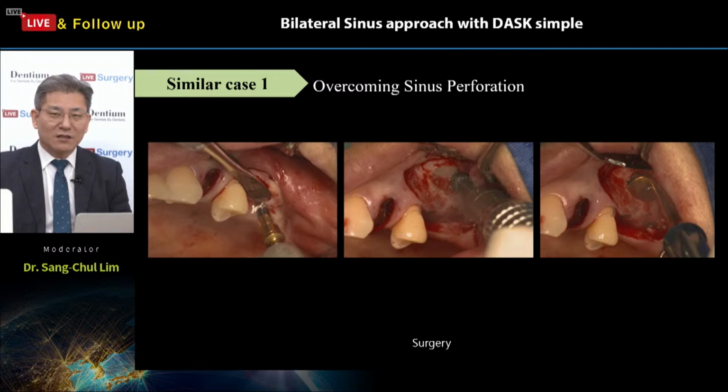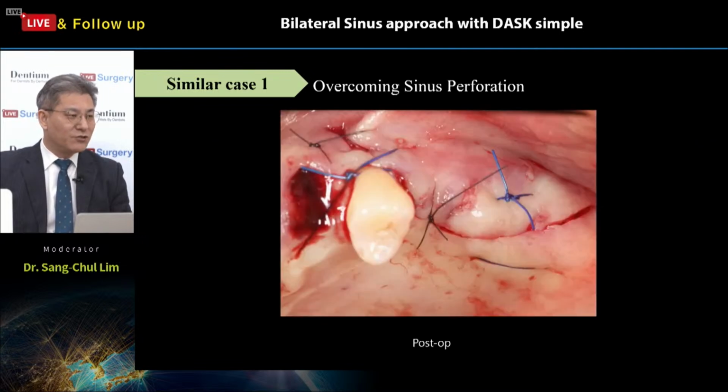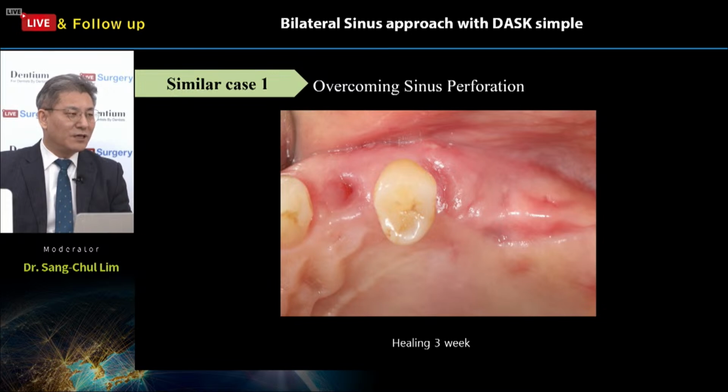Many different types of sinus curettes are available for detaching the sinus membrane from the sinus floor and lateral wall, and then we can apply the Osteon 3 collagen. Skip the collagen membrane, just put in the Osteon 3 collagen graft material, overcoming the sinus membrane perforation. So that is another option for overcoming the membrane tearing. Then the implantation, suture, and waiting for healing.